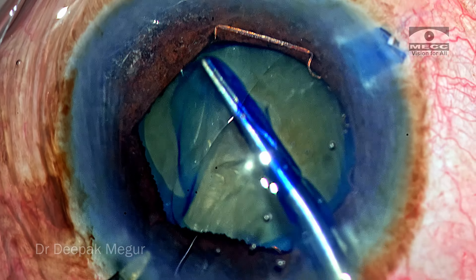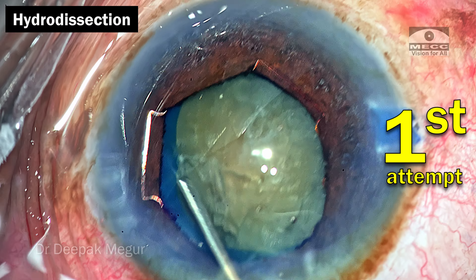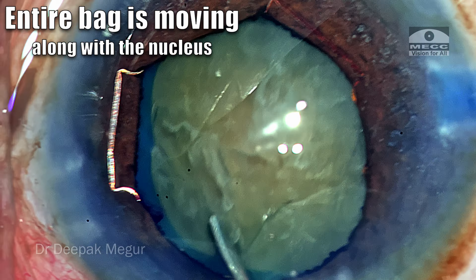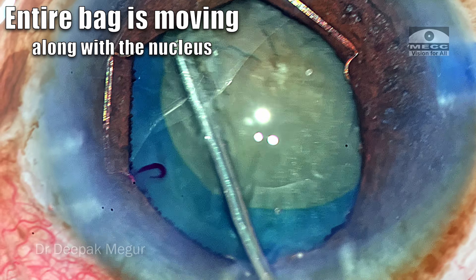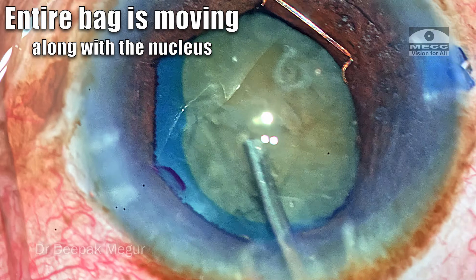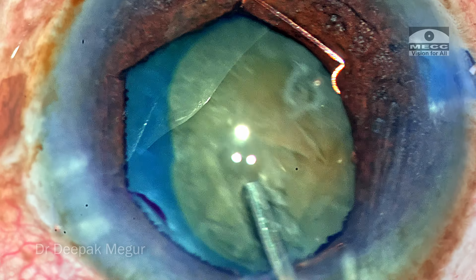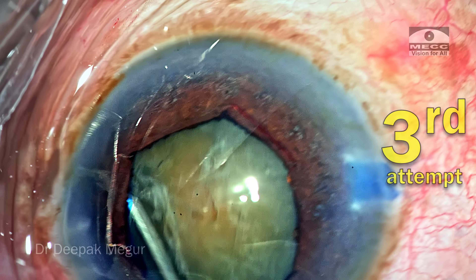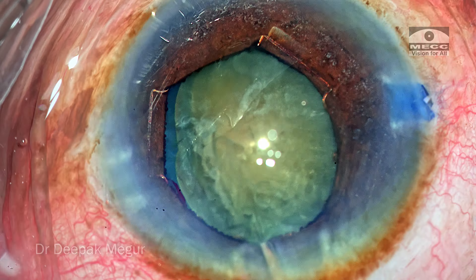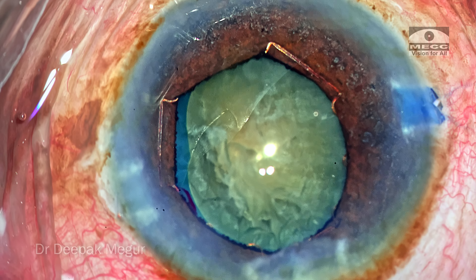I don't want too large a rhexis, as optic capture might become difficult. Hydrodissection is probably the most important step in eyes with zonular weakness. The first attempt is not very successful in breaking all the attachments — as I decompress and nudge the nucleus, the bag is also moving. The second attempt, again decompress, and we can still see the bag moving. Finally, the third attempt: as I decompress and nudge the nucleus, I can see the bag is no longer moving along with the nucleus.